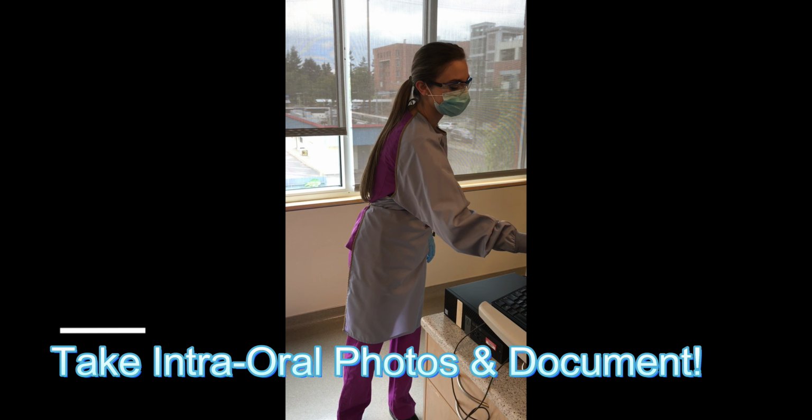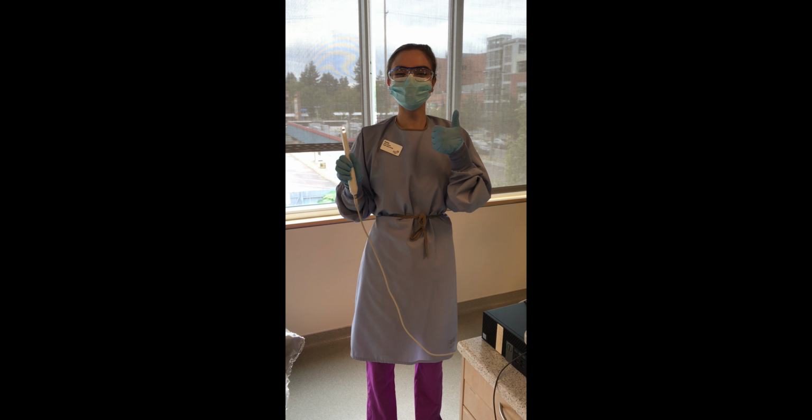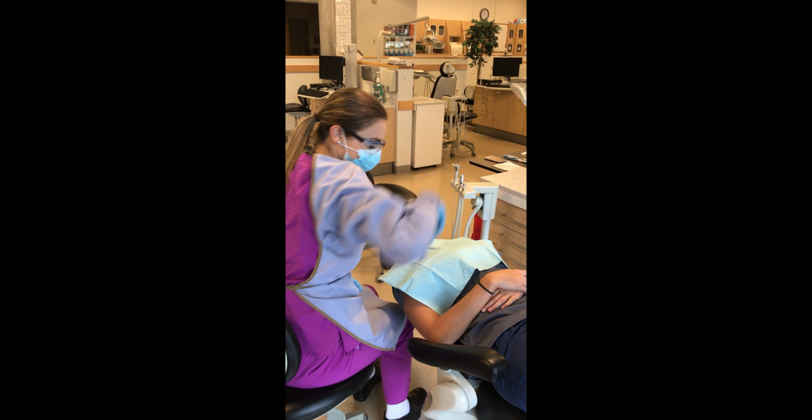Take intraoral photos of any lesions that are not within normal limits and document all findings in the dental history and chart note. Lastly, turn off the overhead light and return your patient to an upright position.